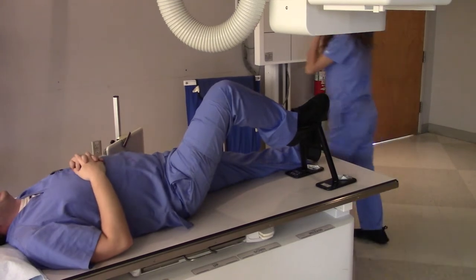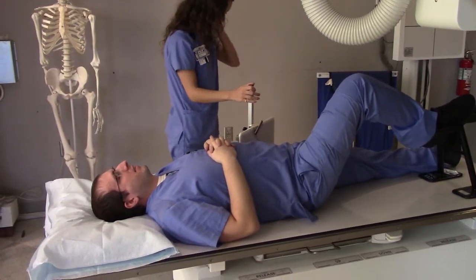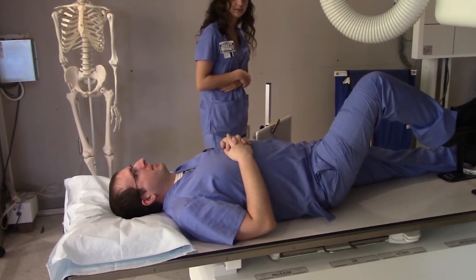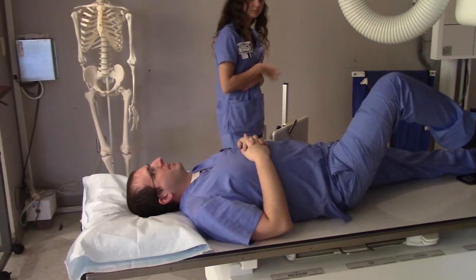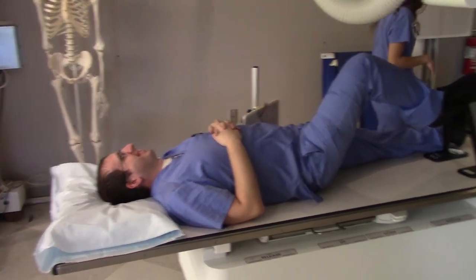So what I did is I put this present right here. Alright, so far so good.